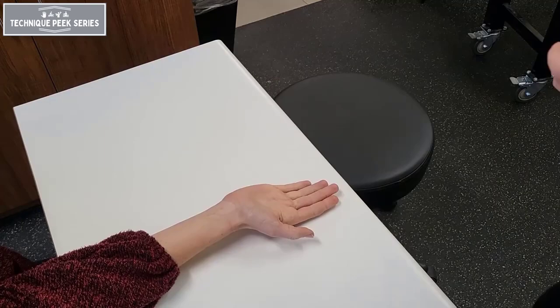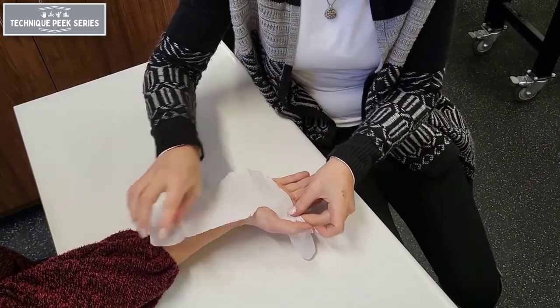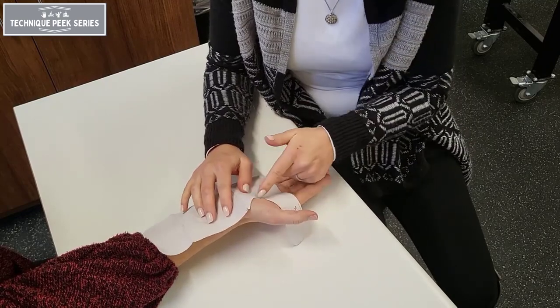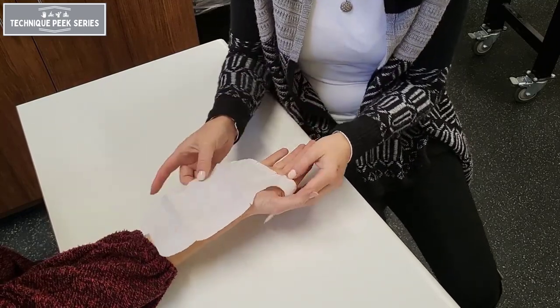Before cutting the material out, be sure to check the fit of your pattern on your patient. Here we want to make sure that both the thenar eminence and the distal palmar crease are cleared.